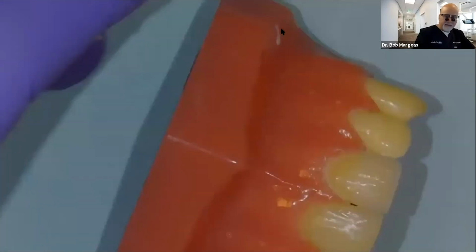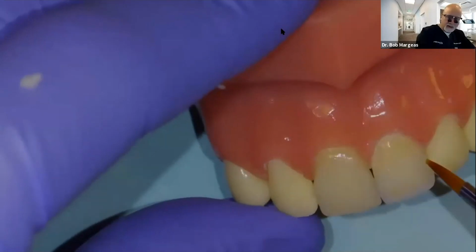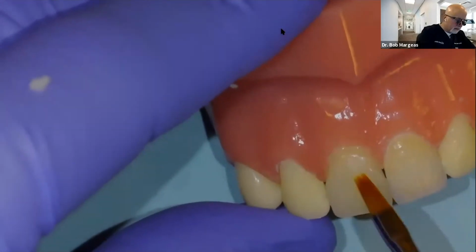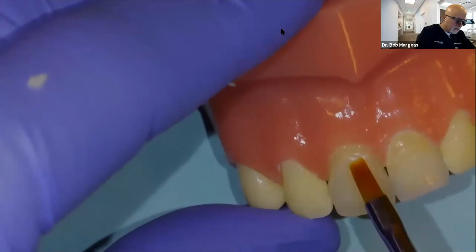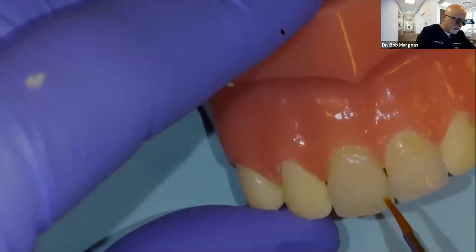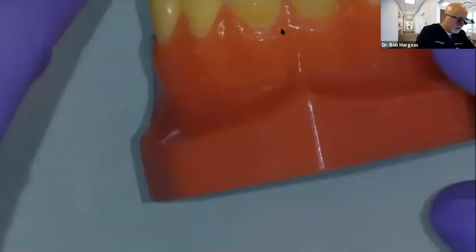So you have to see what you like if you're a sculptor or a painter. And once again, what am I going to do? I'm going to blend this in, and this brush with the brush and sculpt or the resin blend allows you the ability to move the material quite nicely, like a ceramist would, when they're doing their work.